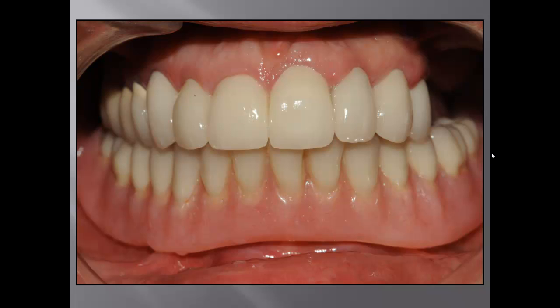Then I put the patient in an upright position and ask the patient again to close the mouth up and down and make sure there's no fremitus. So my point is, when I establish the front guidance, I want to make sure that I have only blue marks. There are no red marks on the front teeth from 7 to 10. On the canines, 6 and 11, I want to make sure I have blue streaks and red dots.